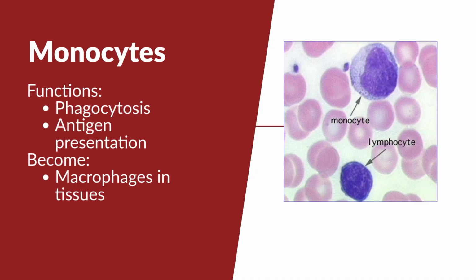Let's talk about monocytes. It's just another review. I went through all of these so you have a better idea of them. Monocyte morphology: the largest normal white blood cell. It has a folded nucleus and a gray-blue cytoplasm, and vacuoles are possible.